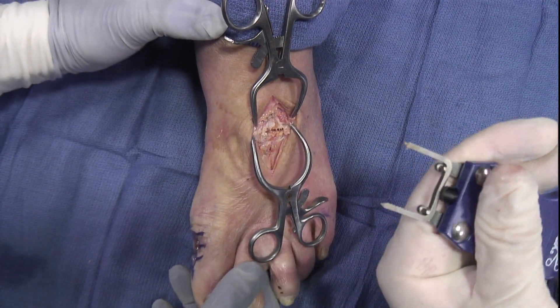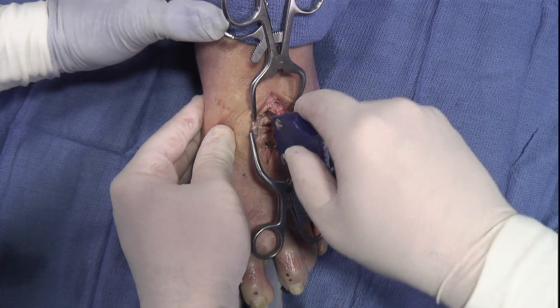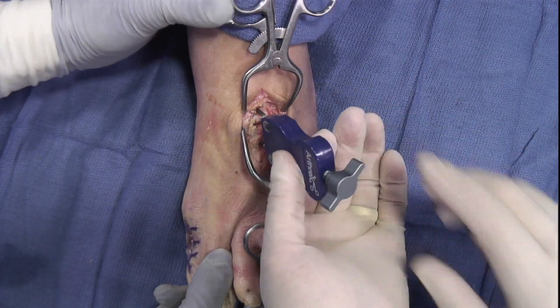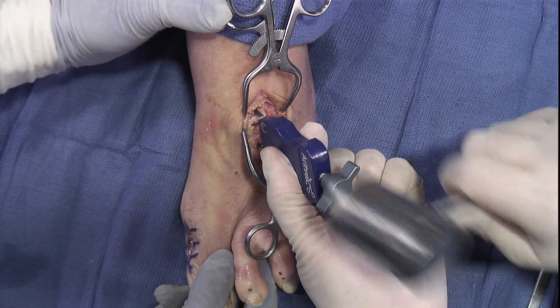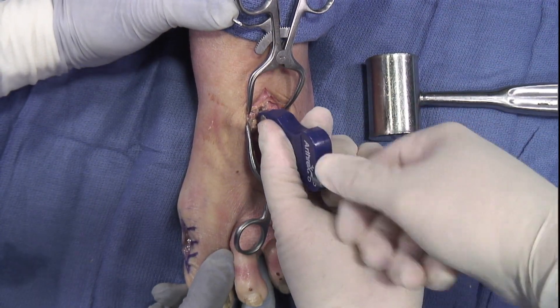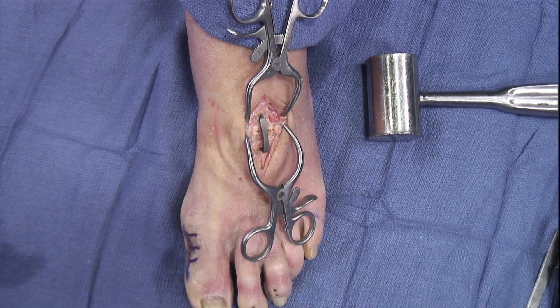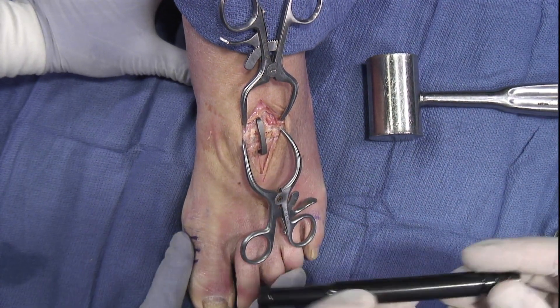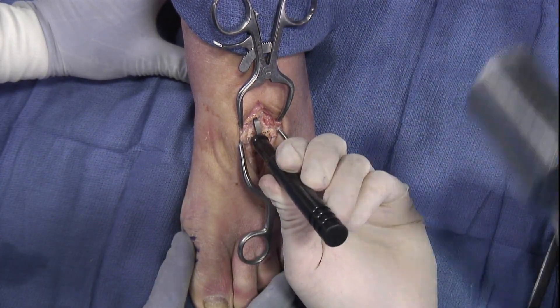I'm going to spread this open just a little bit more, and here's one hole, here's the other hole. That'll be implanted into there, and we can gently impact it. It's not going to go all the way because we have that device which will prevent it from doing so. We need to tamp this into place with the appropriate lid size tamp, and we can do a little bit distally.